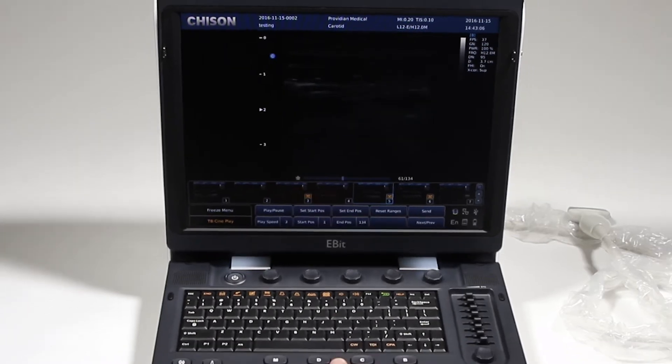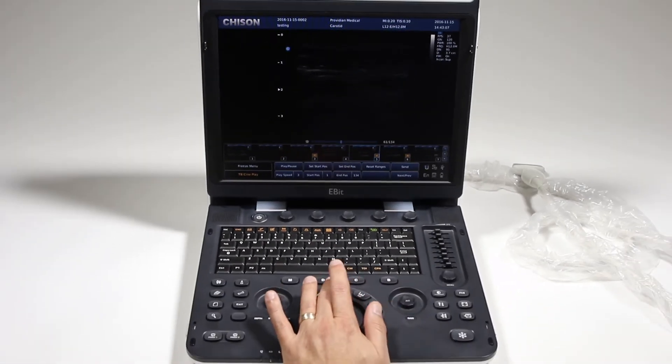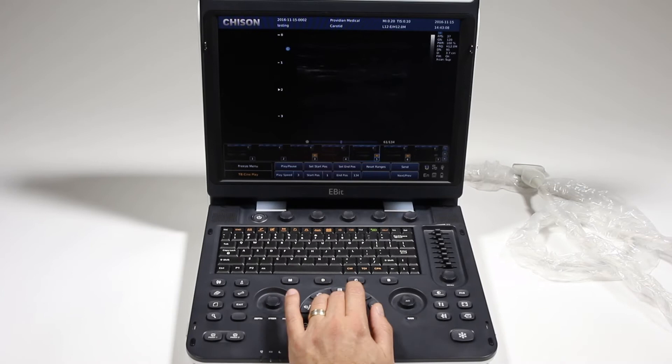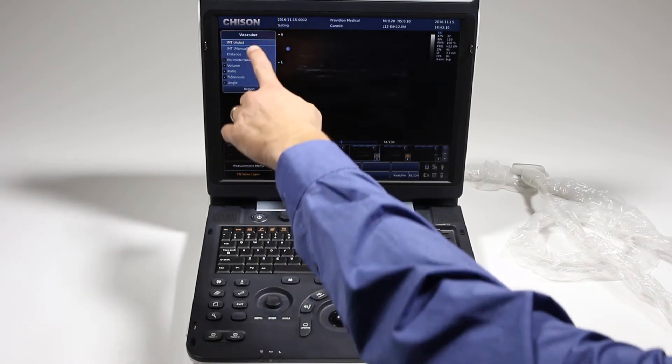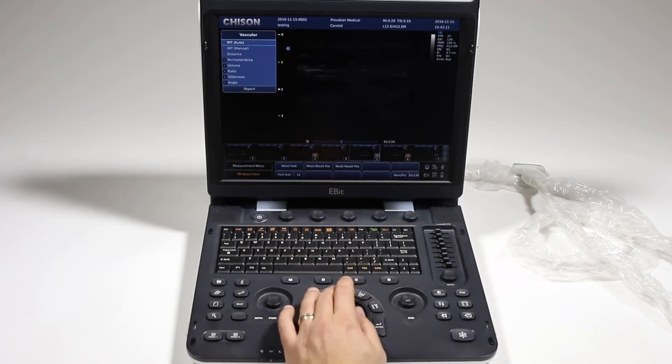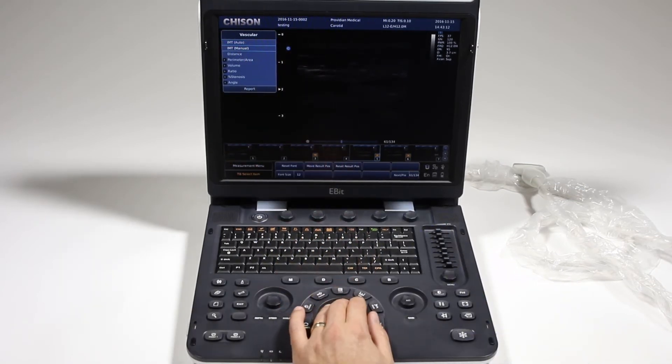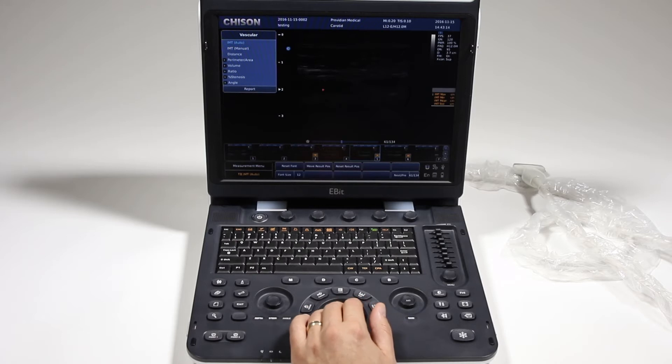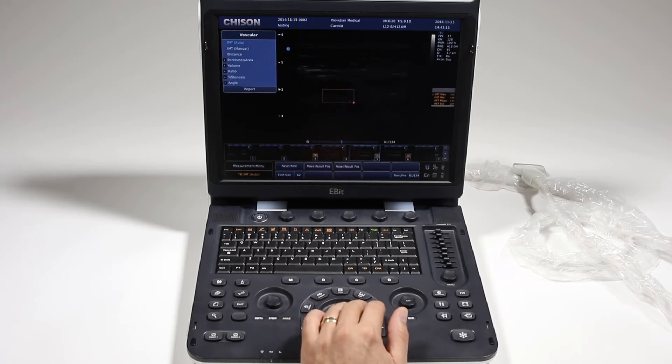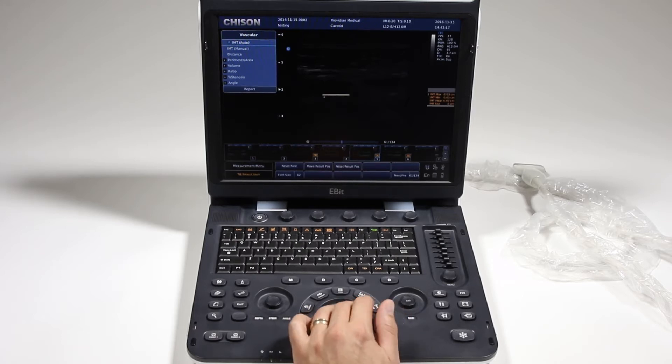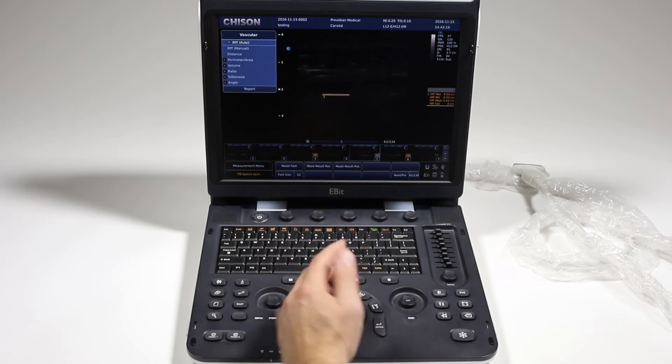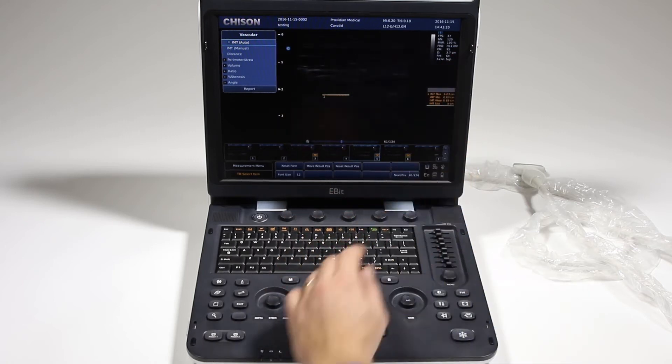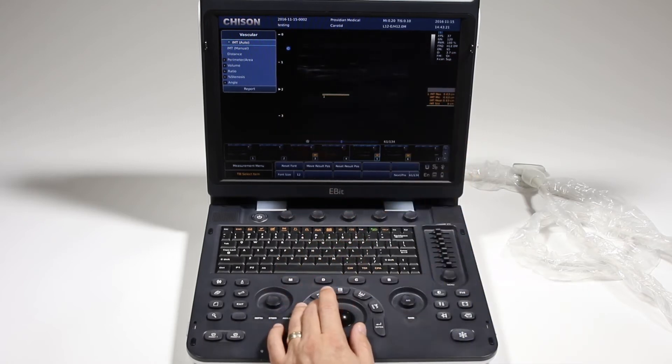I can take a measurement on it. Choose IMT. Just show the IMT real quick. Well, this isn't a good image for it, but to do the IMT, you'll just do that and it's going to identify the IMT and take your measurement for you.